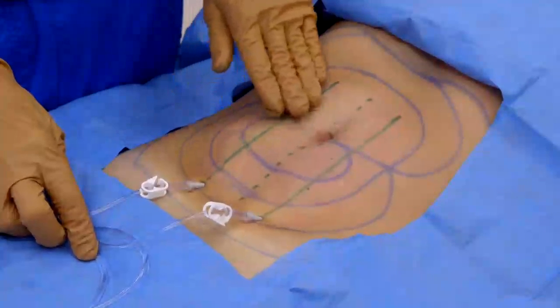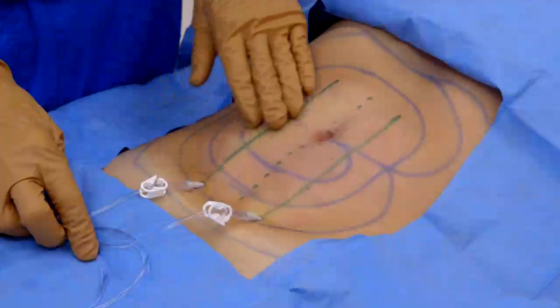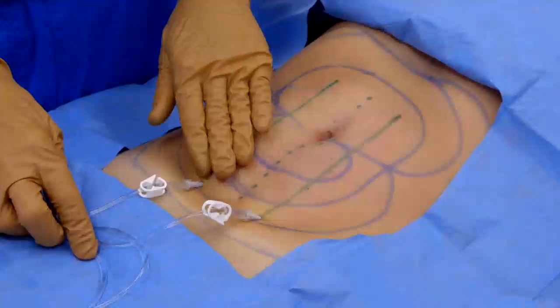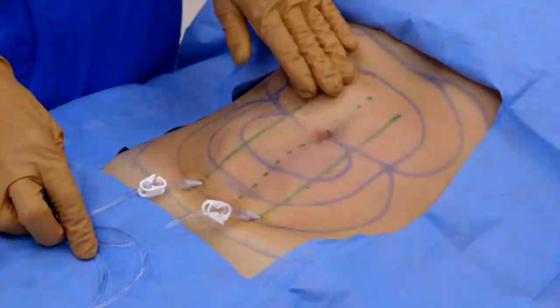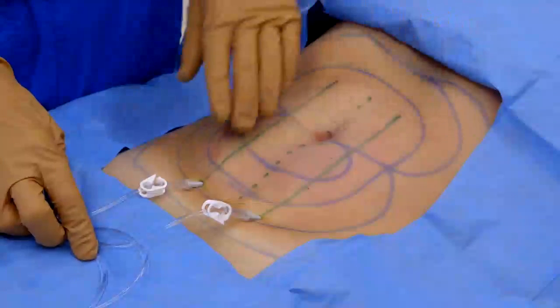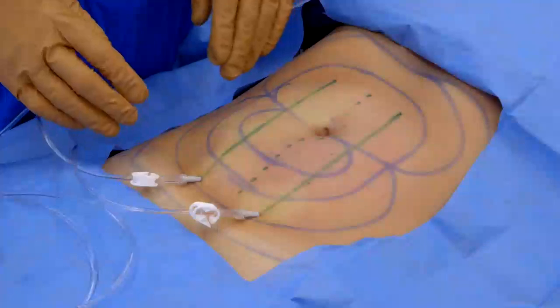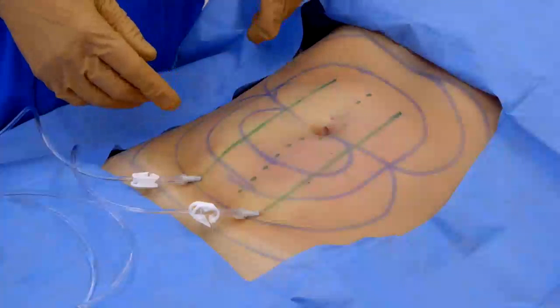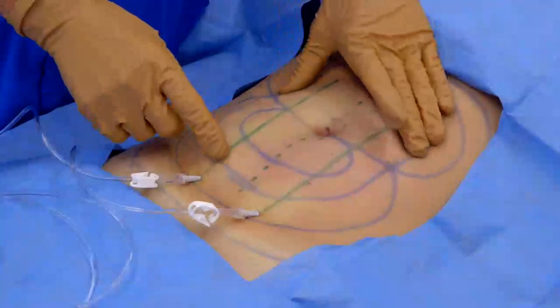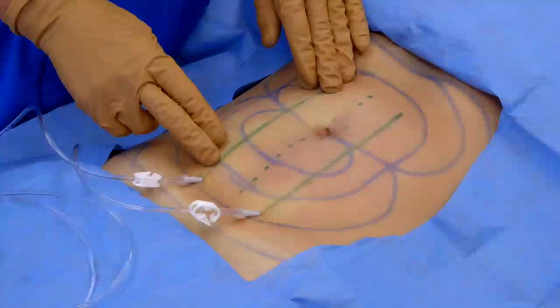We've now infiltrated approximately 700 milliliters of fluid, and as the tumescence occurs it spreads laterally and will infiltrate the peripheral tissues with the local anesthetic solution. If you look carefully you can see some of the vasoconstriction that is occurring as well as the tumescence. It is now getting firm and tumescent. You can appreciate that this tissue is now swollen and firm, containing approximately 850 milliliters of fluid, with extensive subcutaneous vasoconstriction.